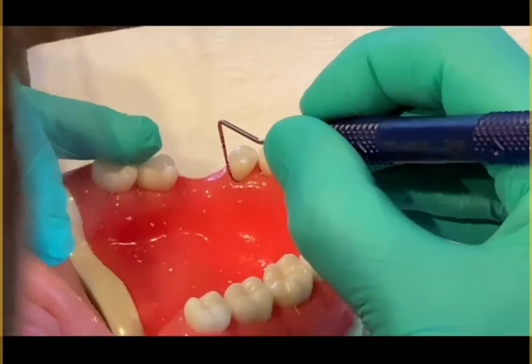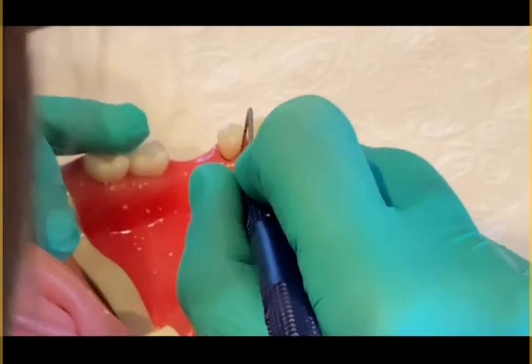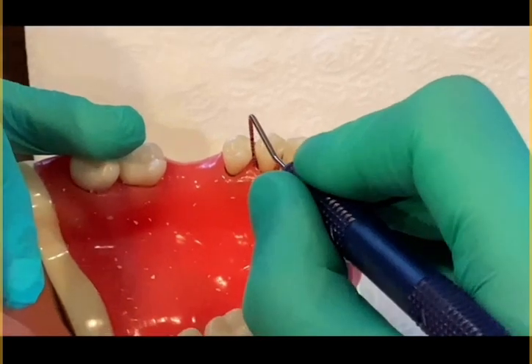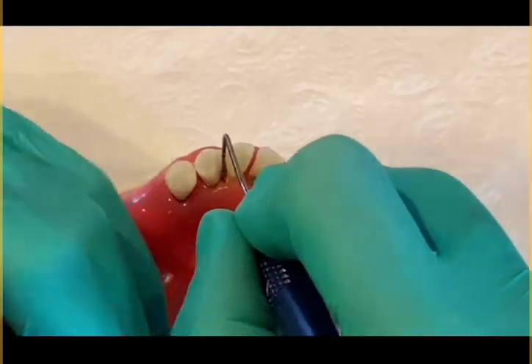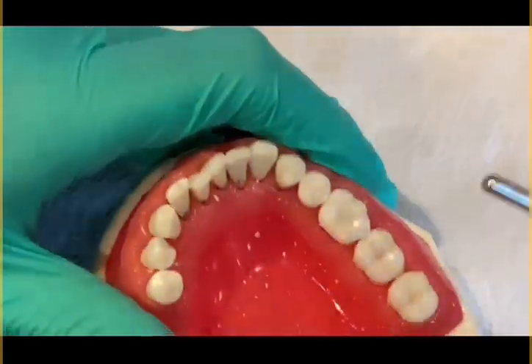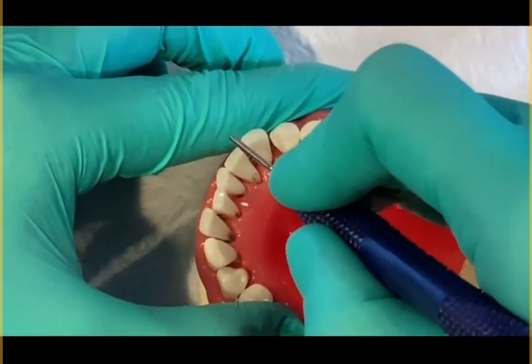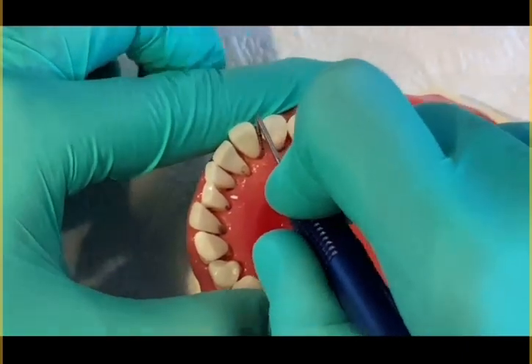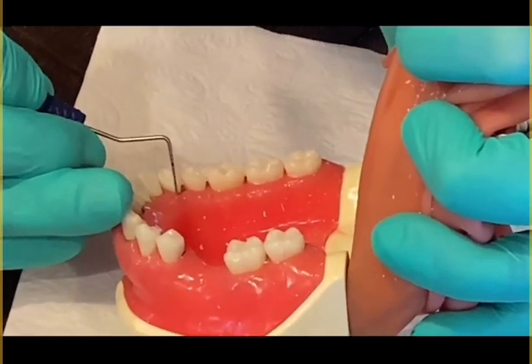4, 3, 4, 3, 2, 3. Now I would have done all the anteriors, and then I'm coming back on the lingual on the lower right. So we're on number 27 here. 3, 4, 4. Okay, on to number 28.